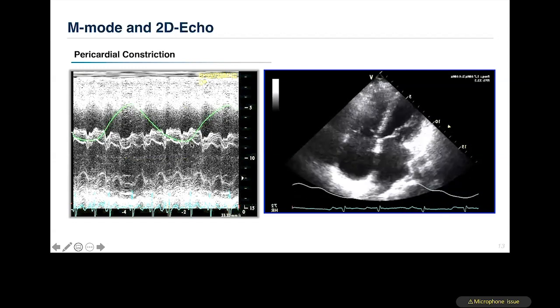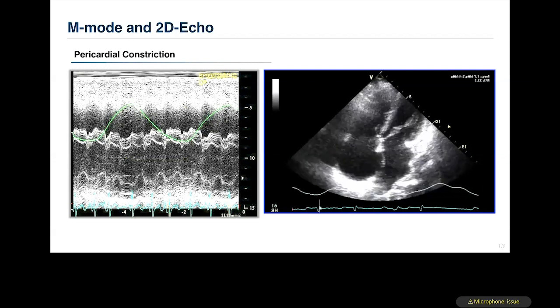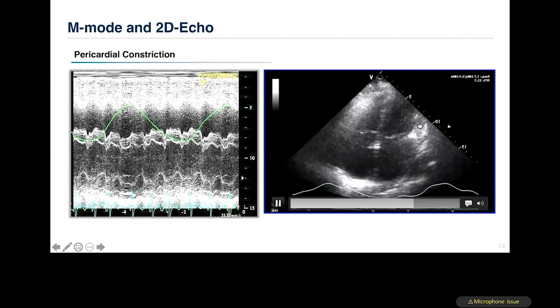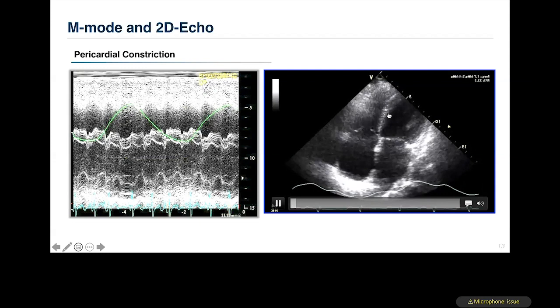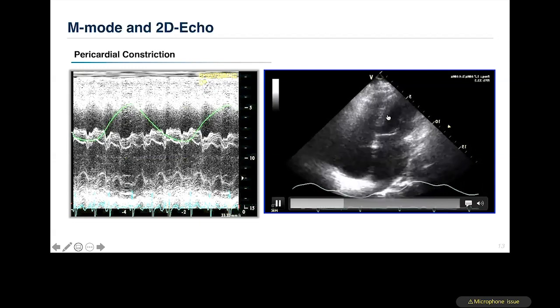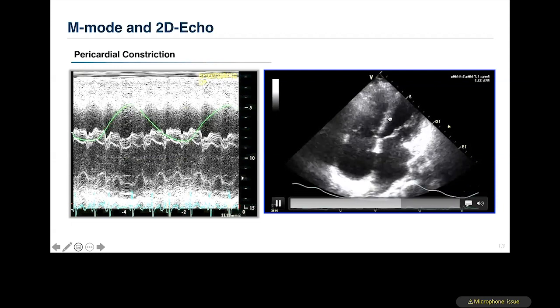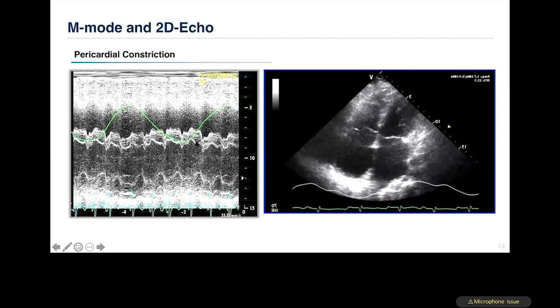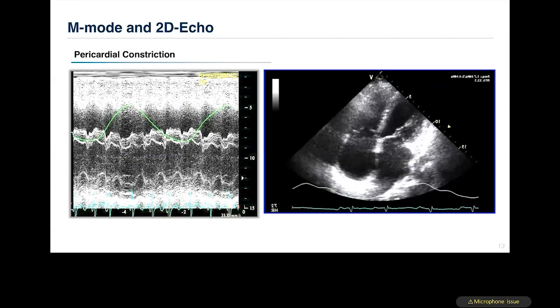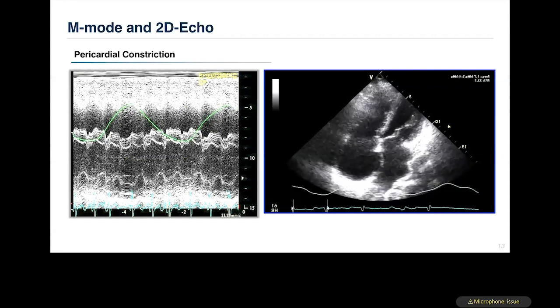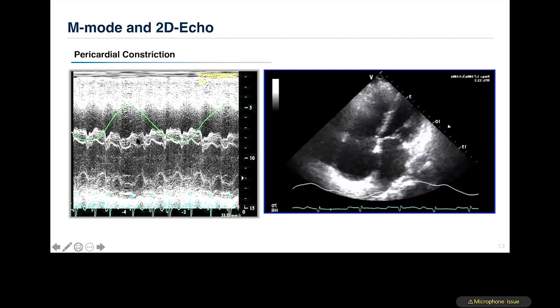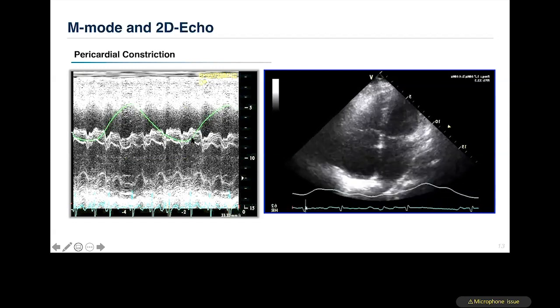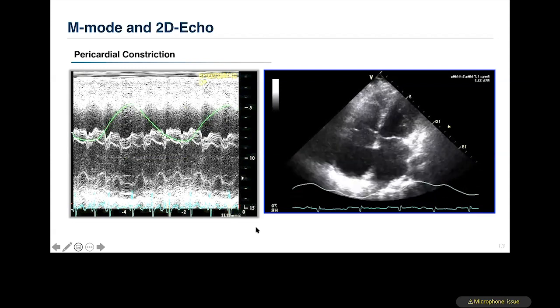Both components can be recognized on 2D echocardiogram — the respiratory back-and-forth motion plus the very high-frequency shutter-like movement during each cardiac cycle, which is better recognized on M-mode echo. In the current era, M-mode echo continues to be used for understanding this abnormal septal motion in constrictive pericarditis, providing much better temporal resolution.